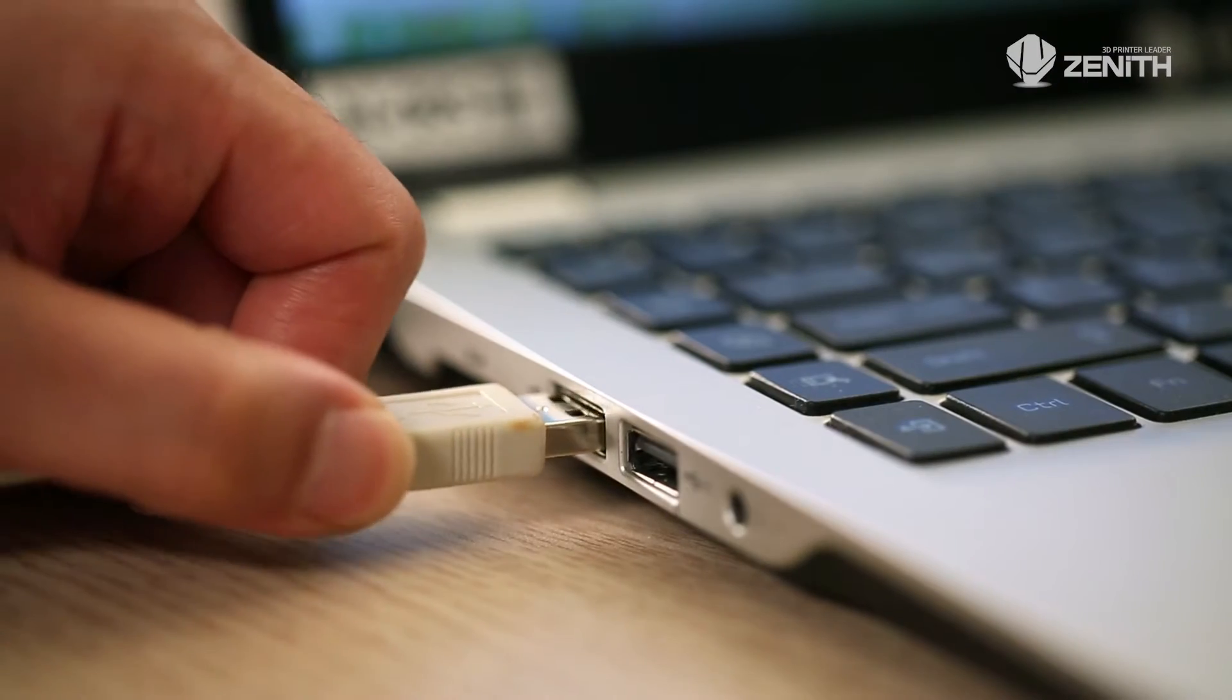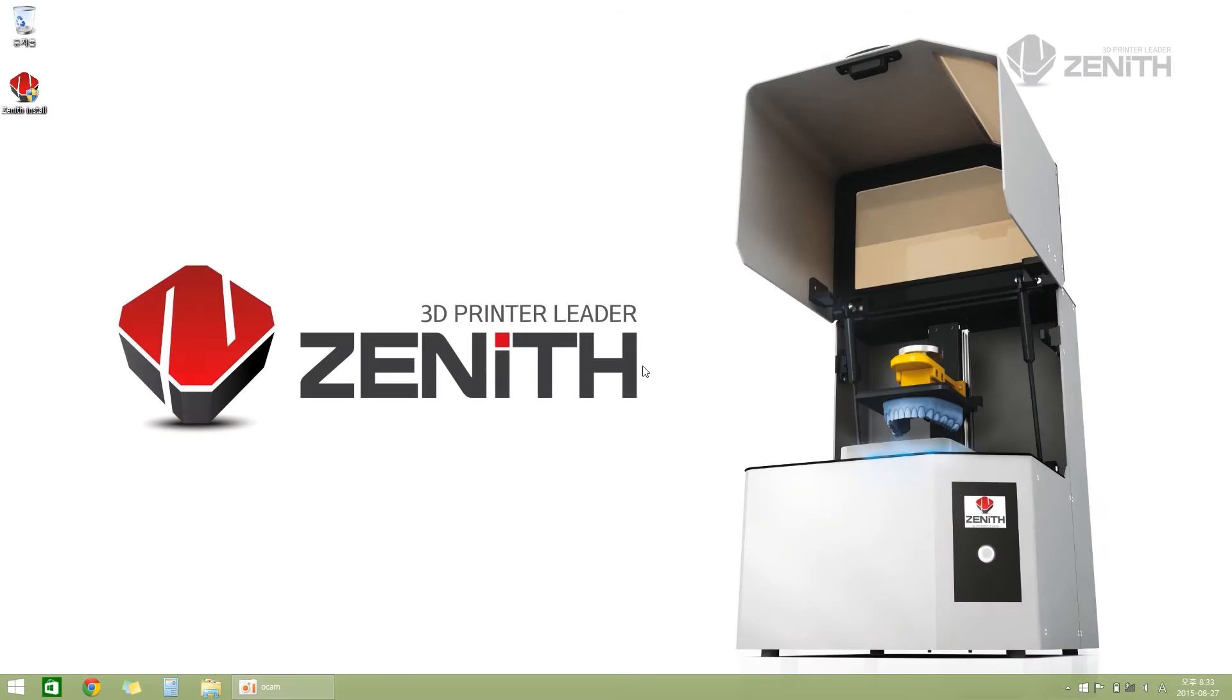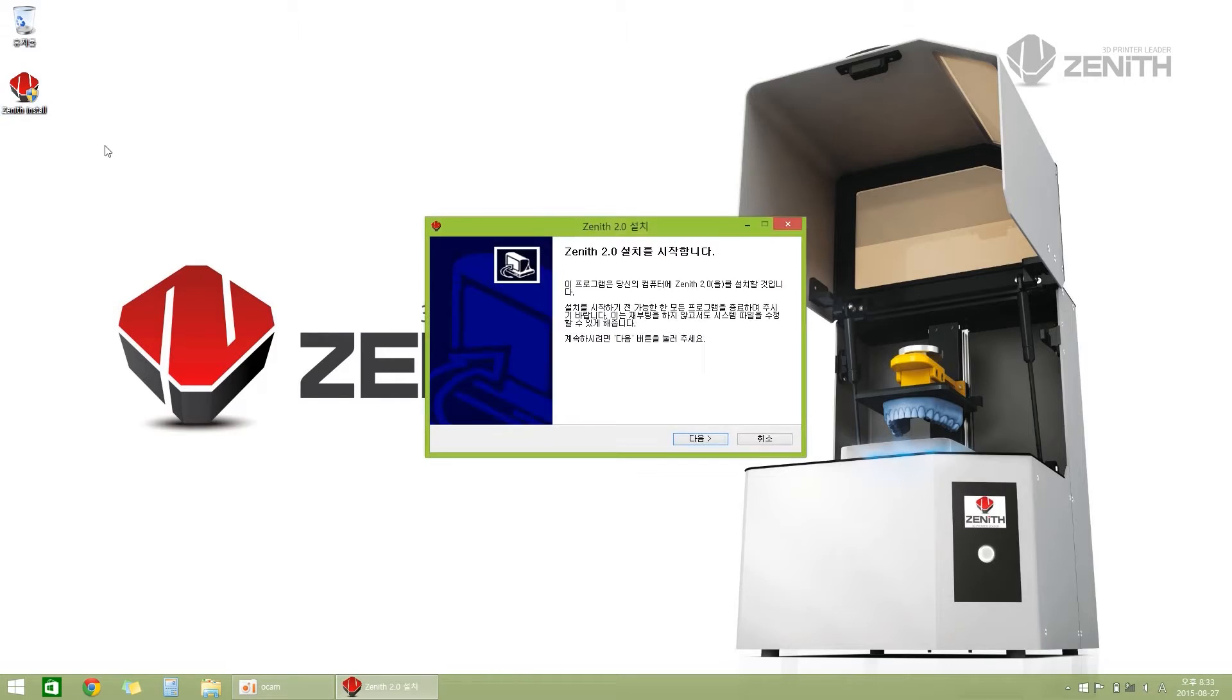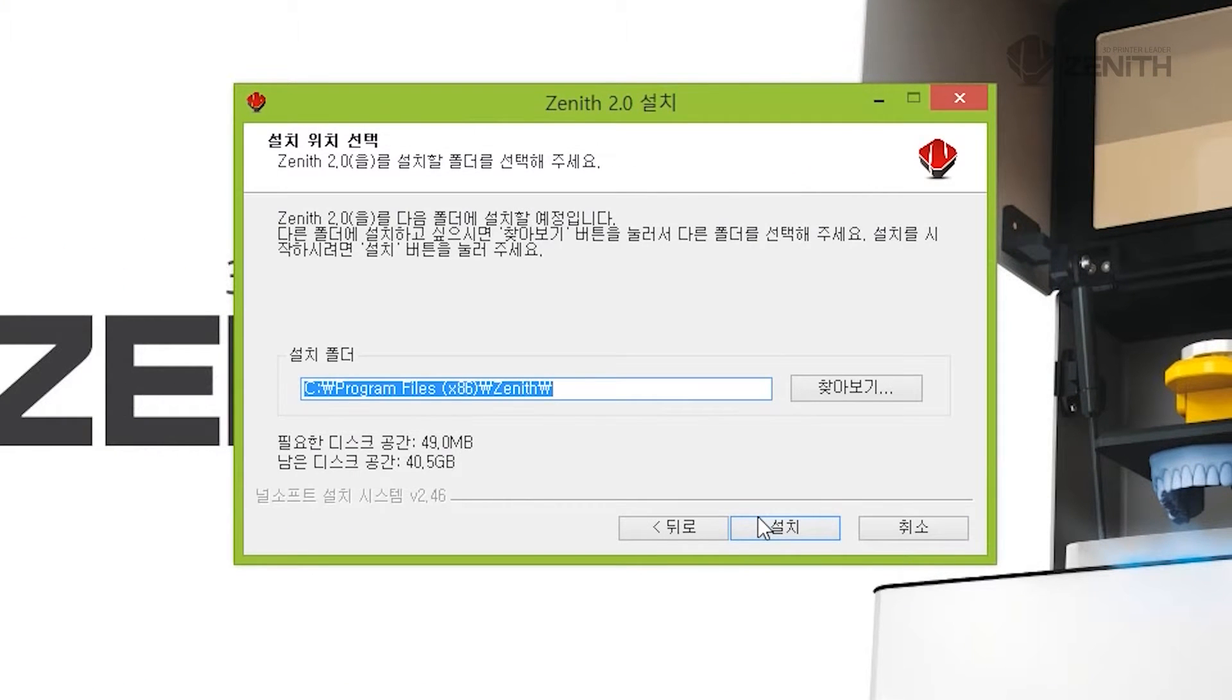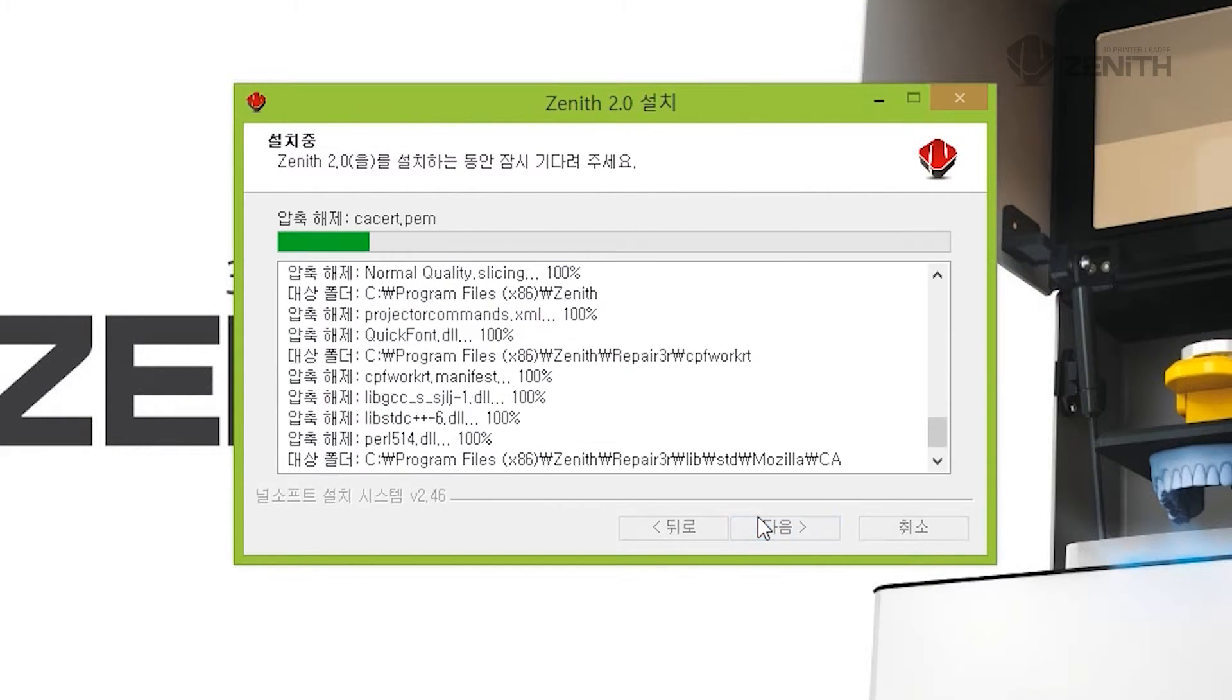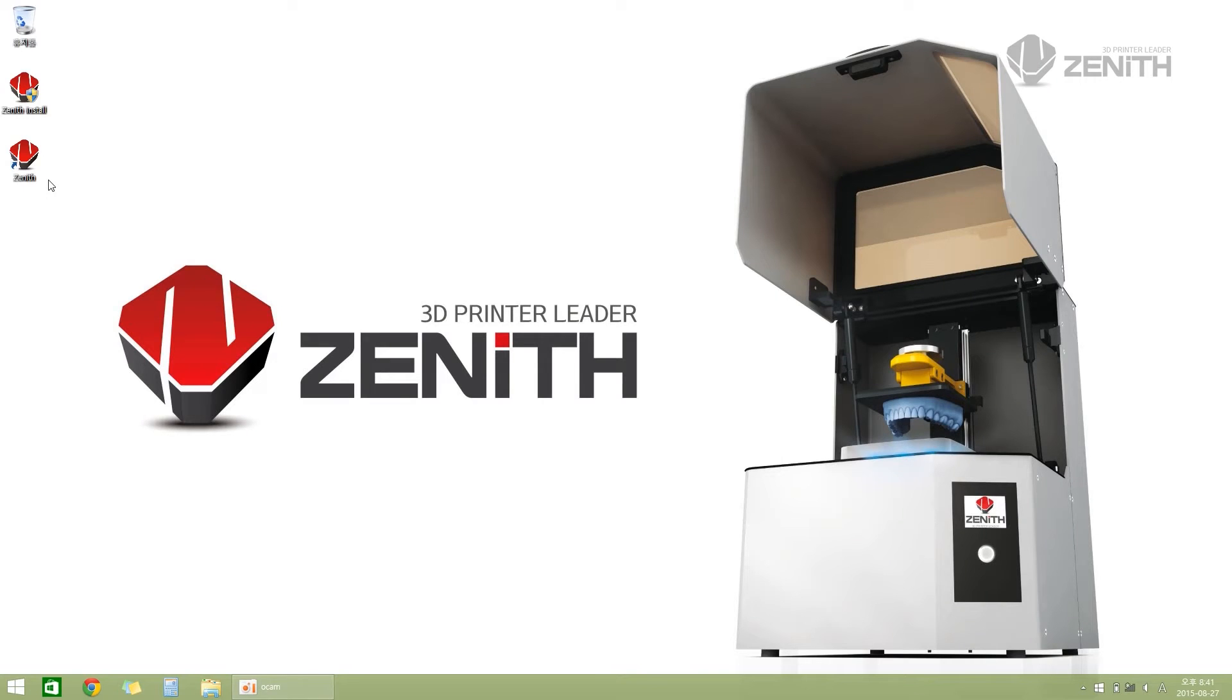Run the installation file downloaded from the Zenith homepage. Select the location where the program is installed by pushing the next button and push the install button to install the program. Click the Zenith icon on the desktop screen to run the program.